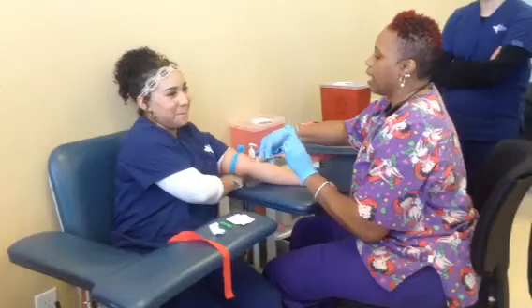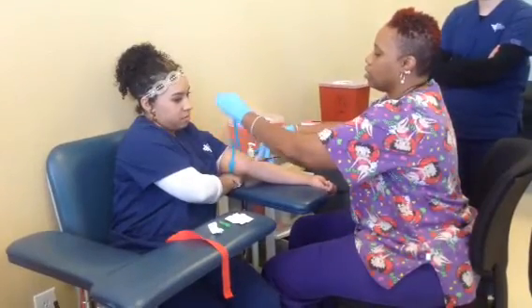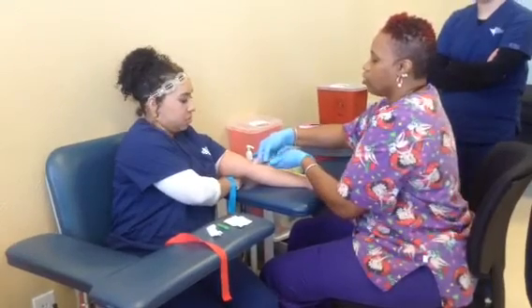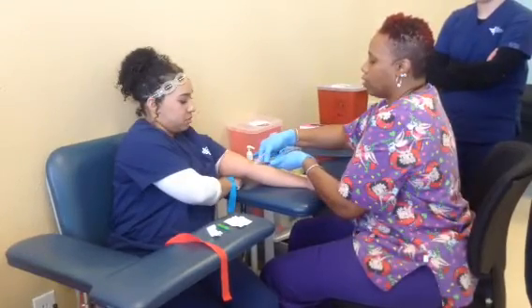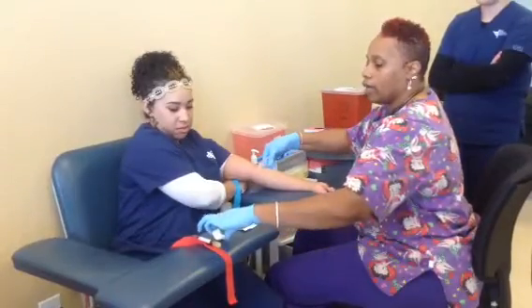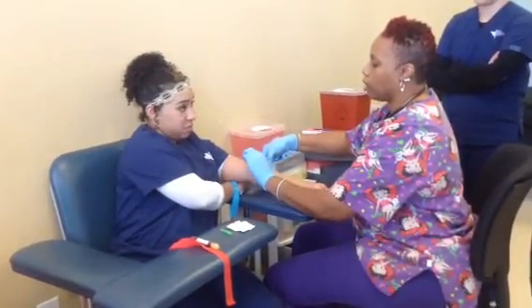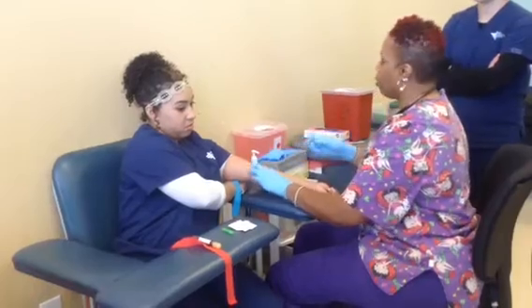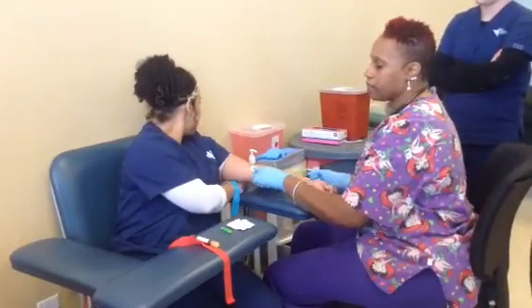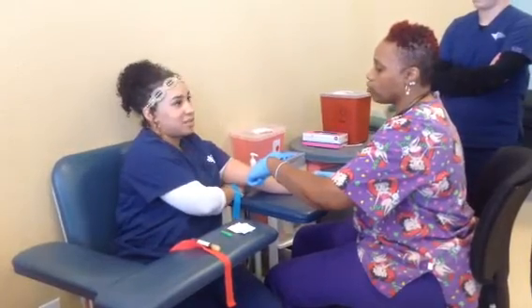Tourniquet time is still important, so what I'm going to do is TTN — tourniquet off first, then tube out of my needle holder. I'm going to take it and set it off to the side. Then needle out of the skin. I'm going to hold above the site, come out quick, click close, and drop into the sharps. Now I'm going to have my patient hold pressure for me.